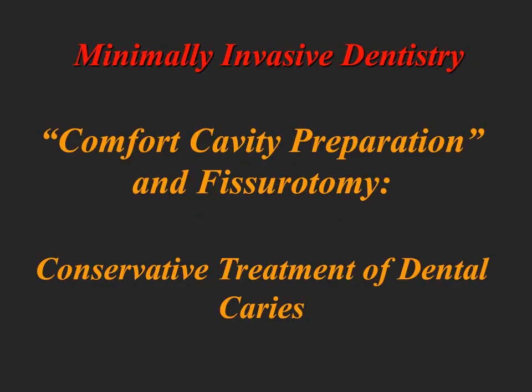So let's talk about this comfort cavity preparation to fissurotomy as a conservative treatment for dental caries. Because I really think, you know, I grew up in dental school on the GV Black extension for prevention. Today's rule should be prevention of extension. Early diagnosis, using as small instruments as possible, and using materials that will help heal and restore the tooth, not just fill a void.